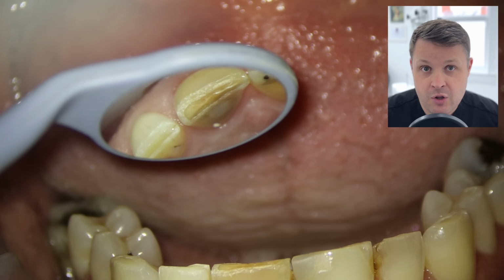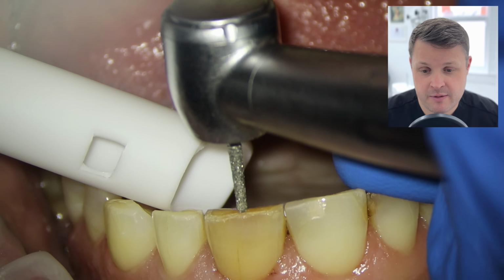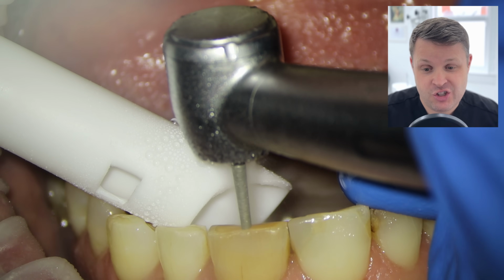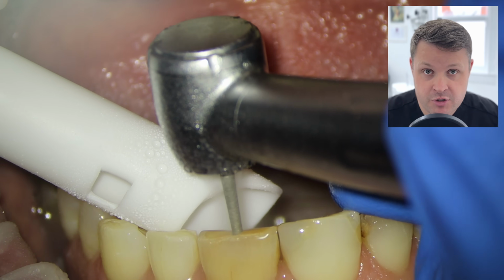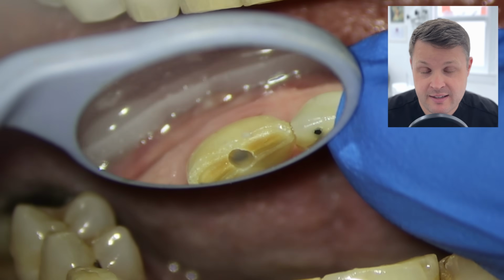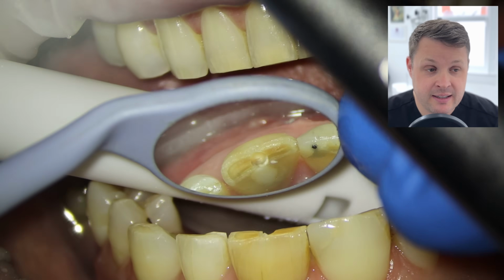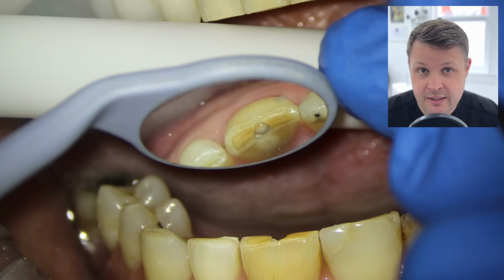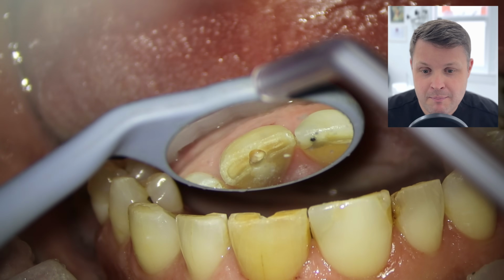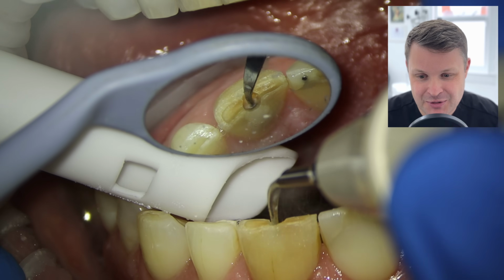In this case, I'm not going to place rubber dam on this tooth. I'm just going to make sure I access the tooth successfully before I do. What I like to do in these types of cases is drill straight down the center of the tooth. Now, the problem with drilling down the center, of course, is you're going to affect the incisal edge, and this can affect the aesthetics of the tooth. But I feel like drilling straight down the middle might reduce the risk of perforation. In this case, it didn't, of course.